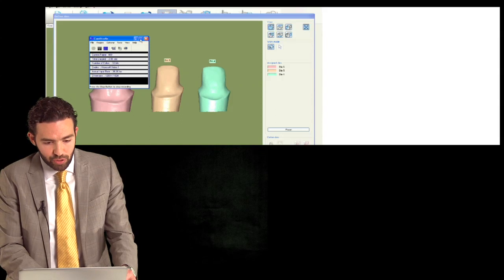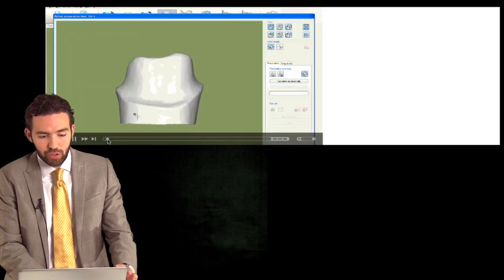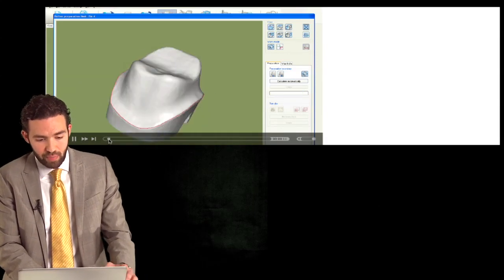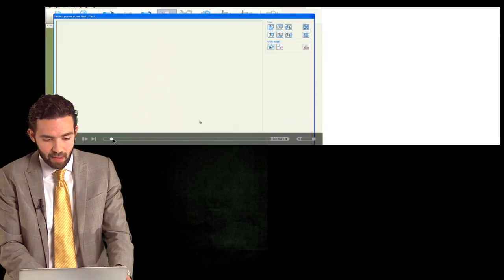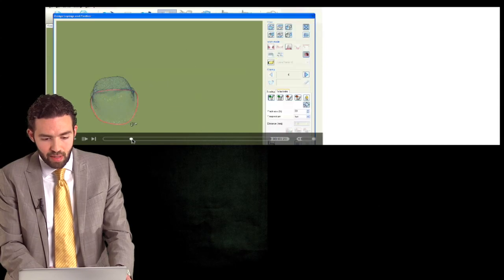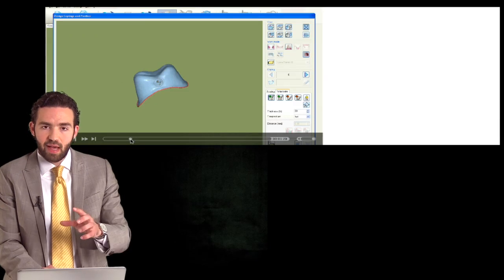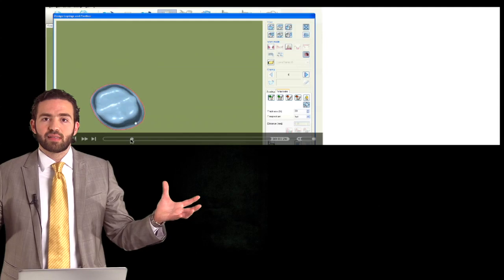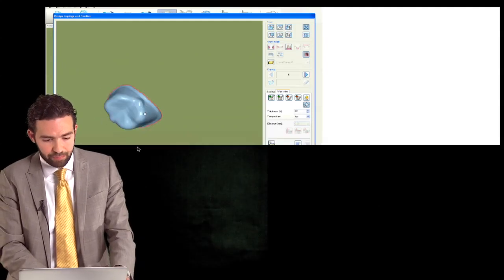And this video is just to show you the type of how virtually you can provide this support on the lingual collars or the proximal and the lingual side of the copings. I'm just going to go through the video quickly, and just to show you here on the molar side where you can easily add wax virtually to the coping on the mesial and the distal side to provide that support on either side.